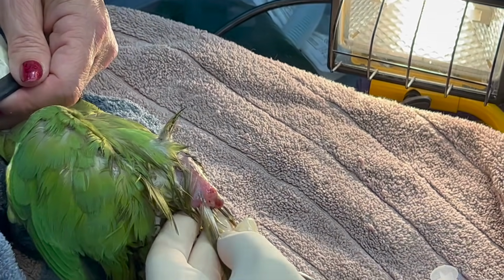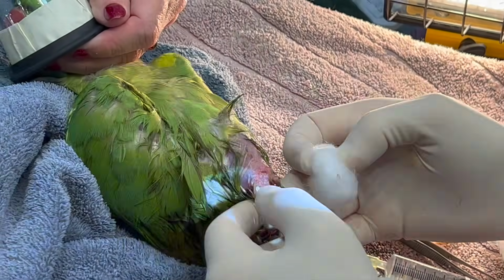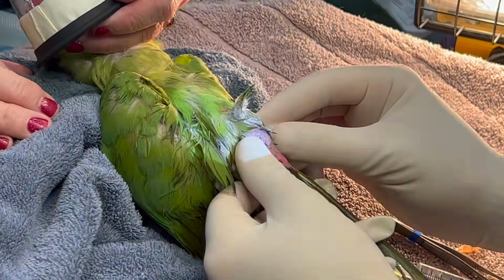Lisa, what are we on? We're on 2. Do you want to go down to 1 3/4, please, or 1 1/2? Yeah. And the breathing okay? It's fine, I was on 36.